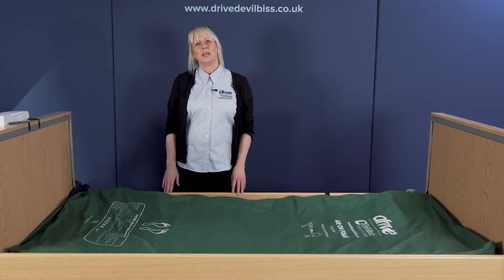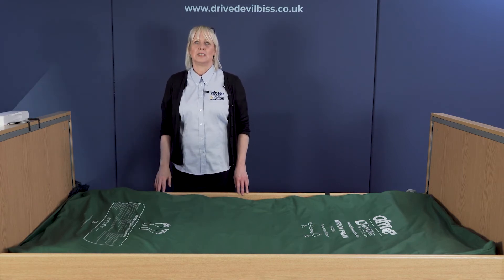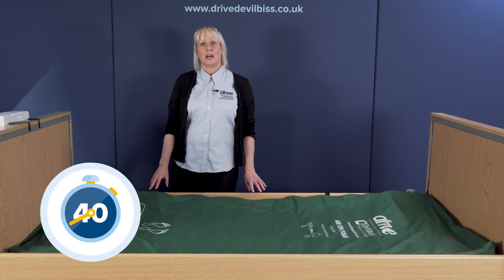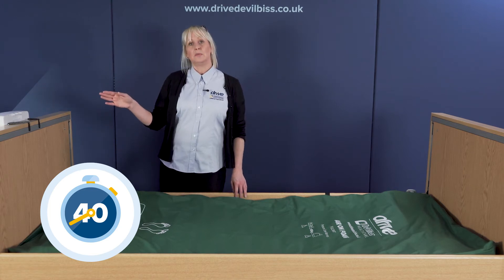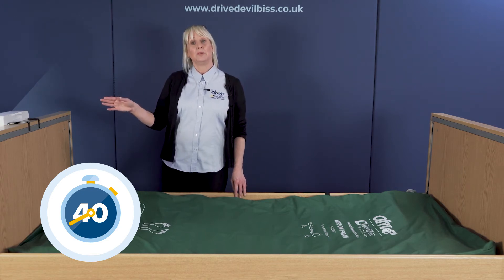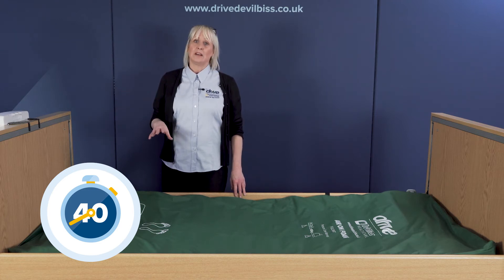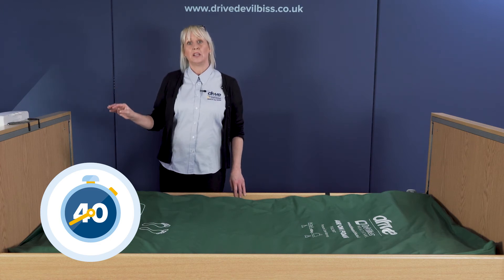Once the pump unit is switched on at the mains outlet and switched on on the unit itself, the mattress will start to inflate. The mattress will inflate over a 40-minute time period; however, to optimize that, you can turn the pressure settings on the pump units up to maximum while it's inflating, and once the mattress is fully inflated, then you turn the dial to the correct setting to meet clinical requirements.